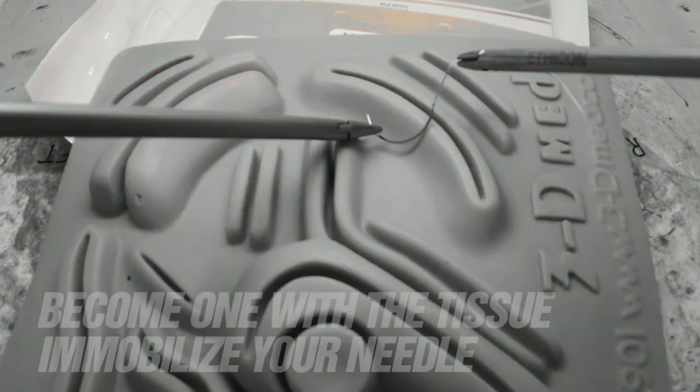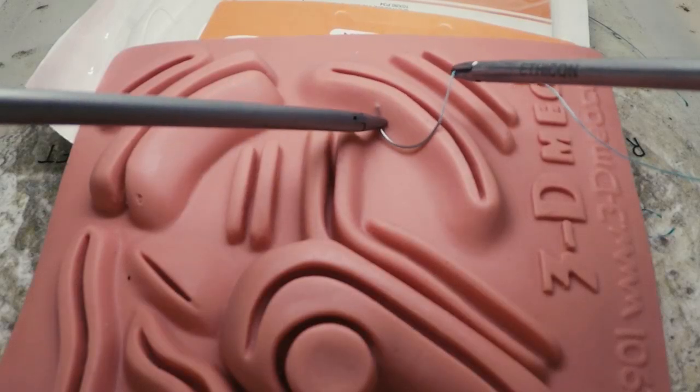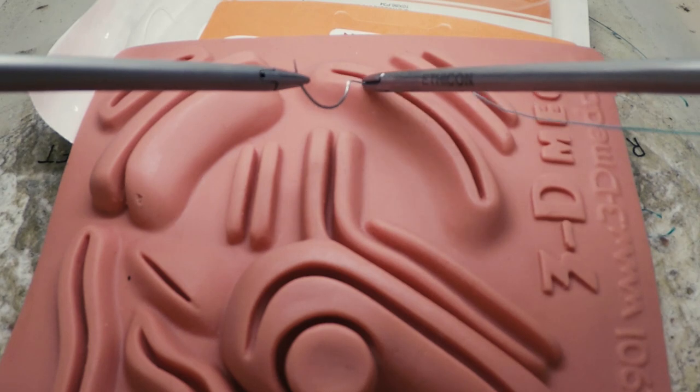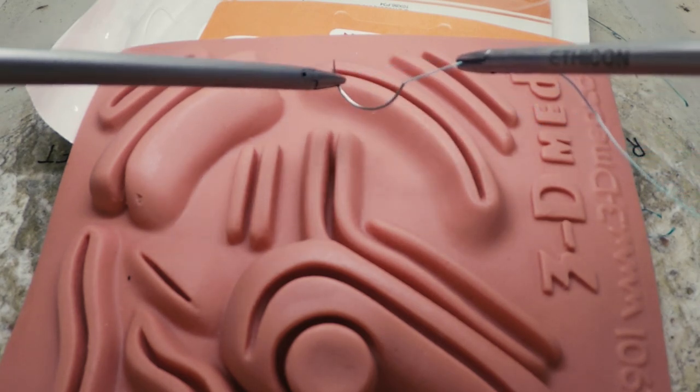Once inside, you should rest the needle on the tissue — it's easier to pick up something stationary. Close the jaws gently to allow rotation of the needle and repositioning so that you can orient the needle parallel to the line of tension you're hoping to create in the tissue.